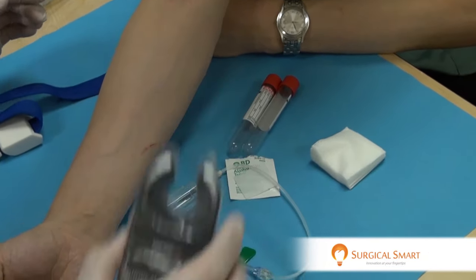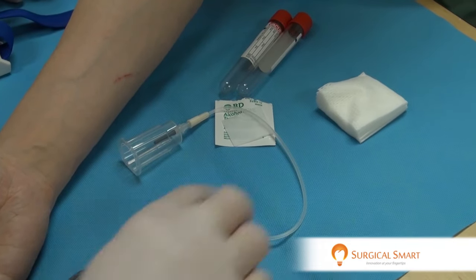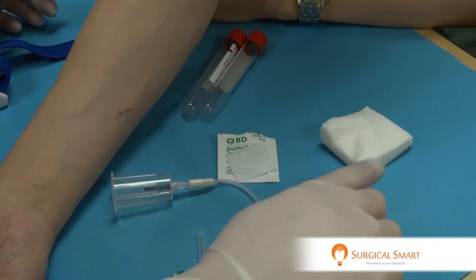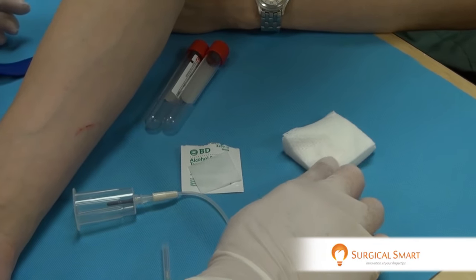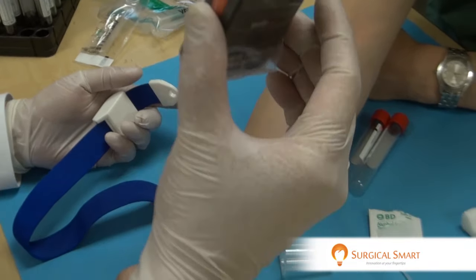Obviously, before you start, you need to ensure that all your armamentarium is present. You've got your brand new butterfly needle, your vacuettes, your alcohol wipes, and your gauze. Obviously, you need your tourniquet. And lastly, your VeinLight.